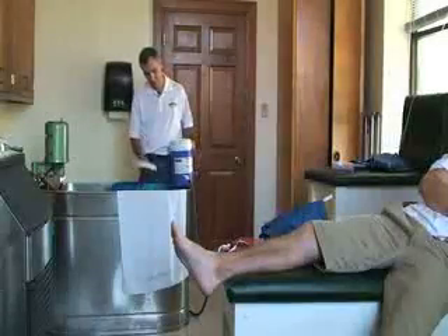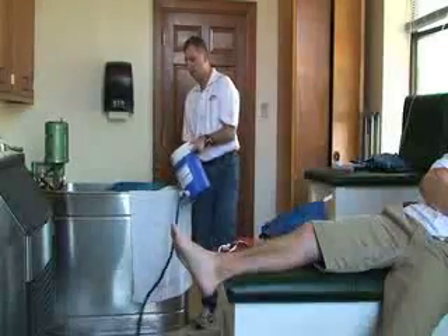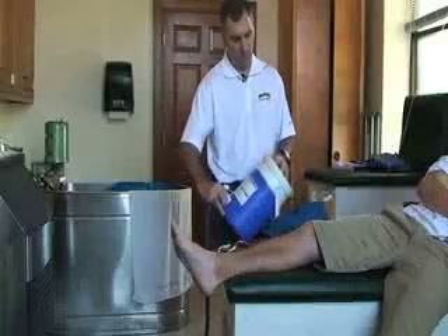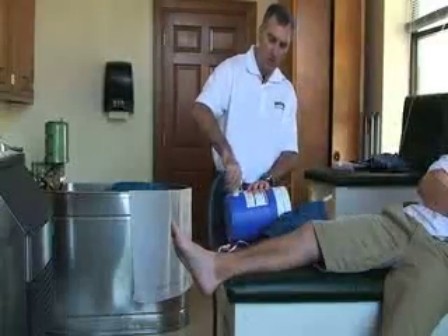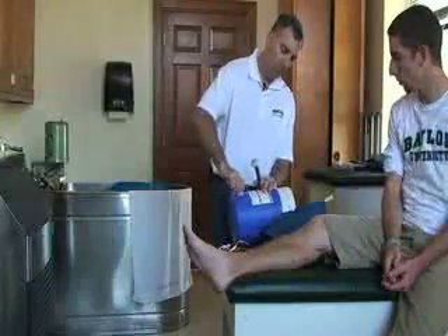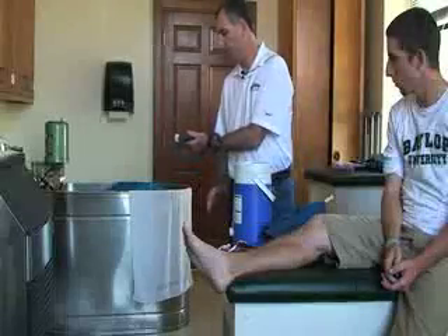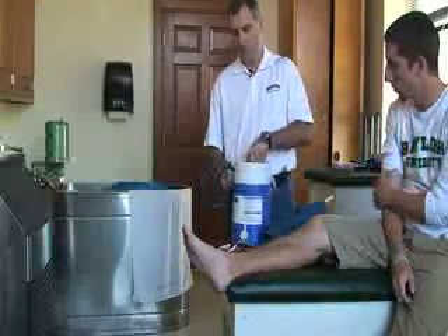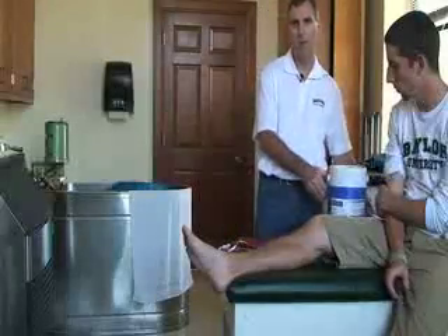Once the water is out, dry the bucket out. Take the attachment off, make sure the bottom vent is closed, and then put the tube back inside so you know where it is for the next treatment. Put the knee attachment back in place, and that is it for the cryo cuff treatment.